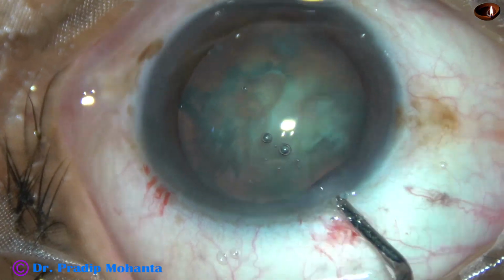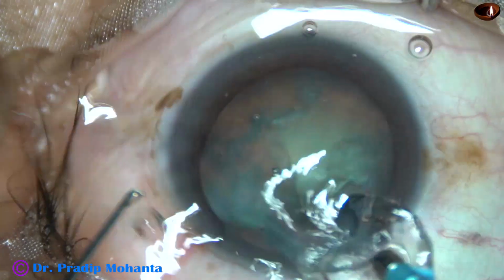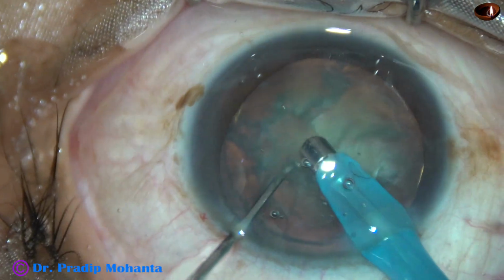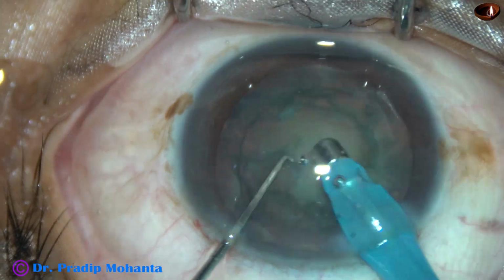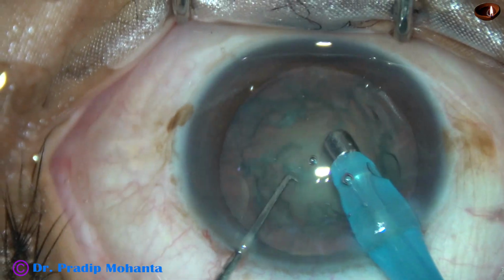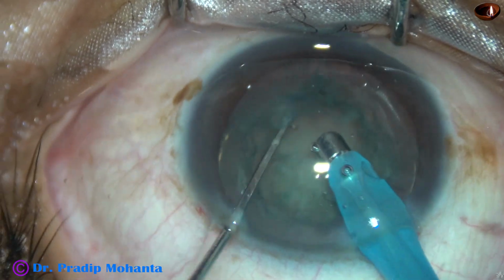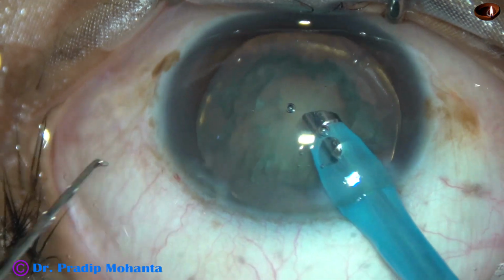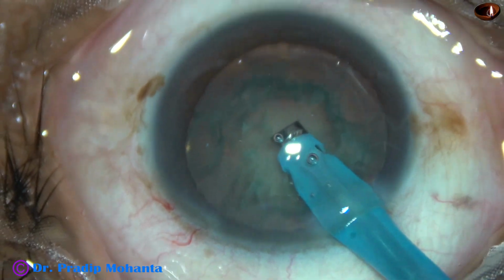And now visco is again used to fill up the anterior chamber, and then the tip of the phaco needle is introduced into the anterior chamber. Some superficial cortical lens matter is aspirated. The nucleus is rotated both clockwise and anticlockwise, and now the handpiece is turned to make the bevel up.